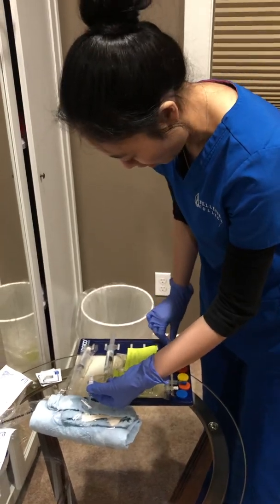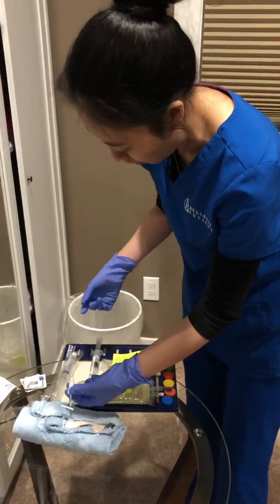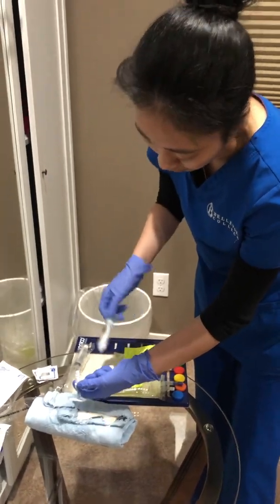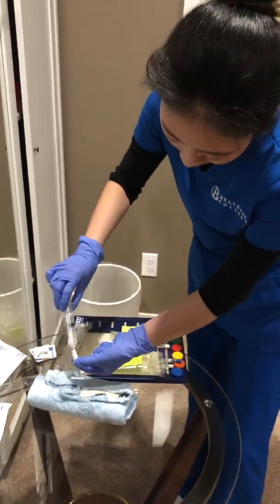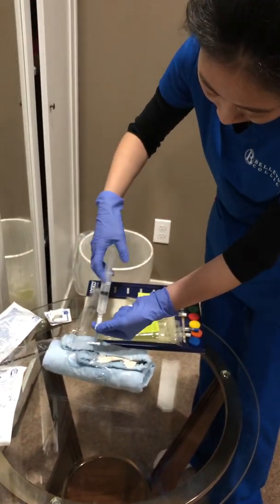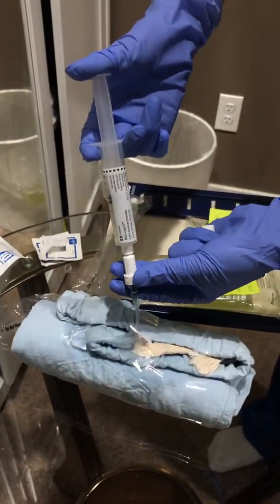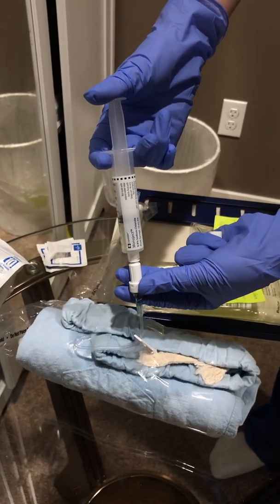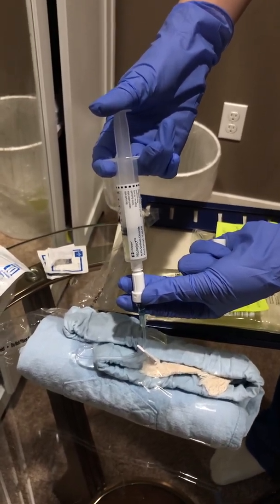And then I'm going to discard those in a sharps container and flush with the normal saline. Sterile to sterile. To make sure all the medication goes into your vein. And I flush it slowly.